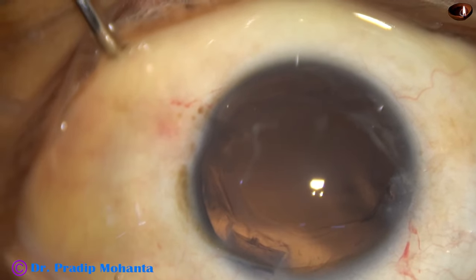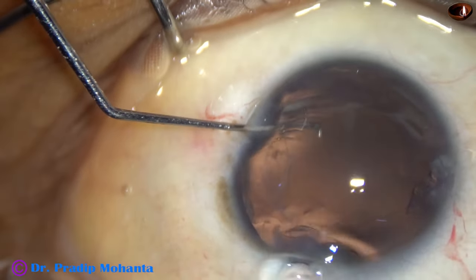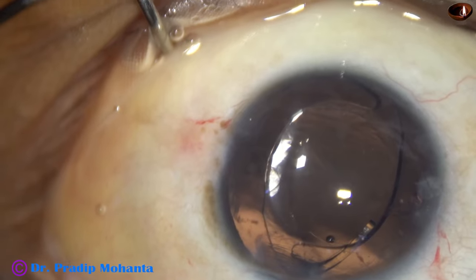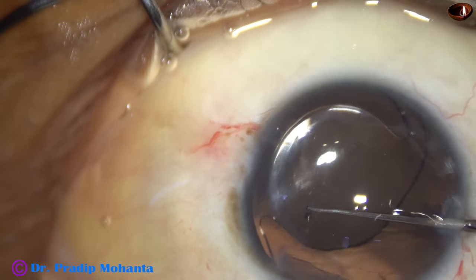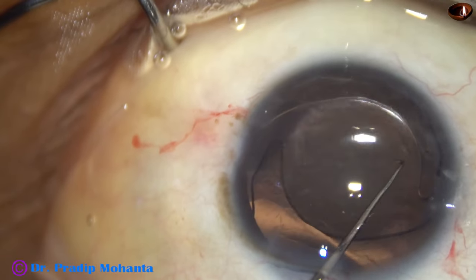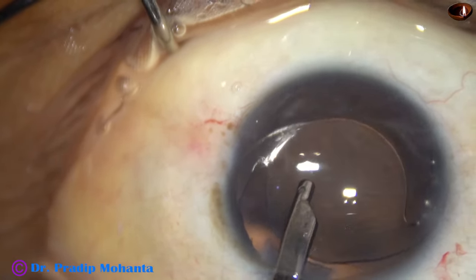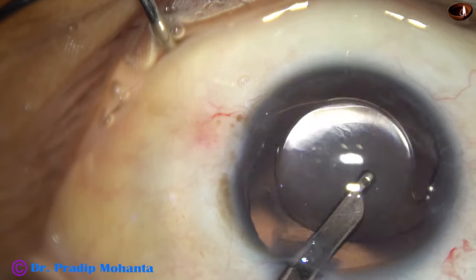Visco again, and now is the time to implant an intraocular lens. This is a hydrophobic acrylic monofocal intraocular lens going into the capsular bag. The zonular dehiscence is from 8 o'clock to 11 o'clock, so the lens is oriented such that the haptic on the right side supports the area of zonular dehiscence. The lens is nicely in the central part and the optic is nicely centered.